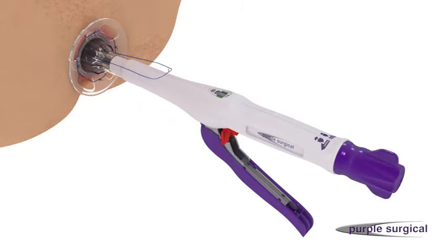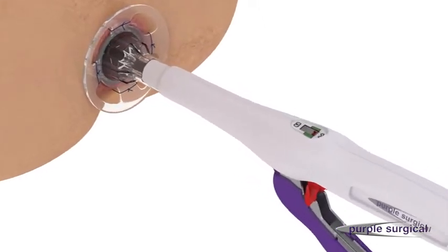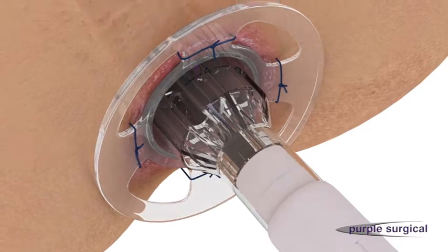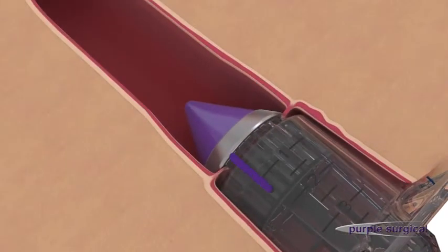Fully close the device by rotating the wingnut clockwise whilst ensuring the 4cm mark is level with the anal verge. The staple line should be at least 2cm above the dentate line.